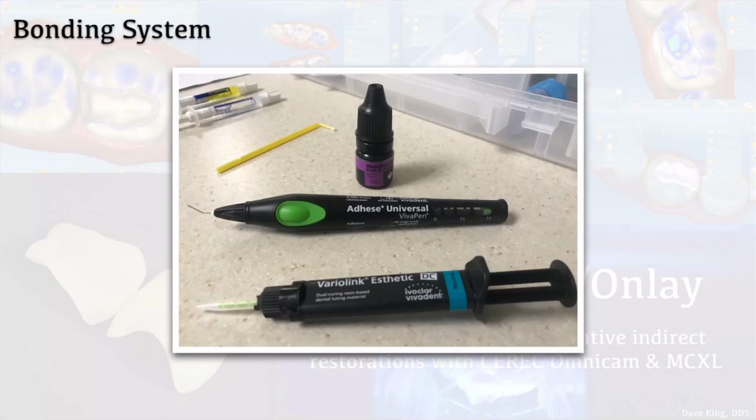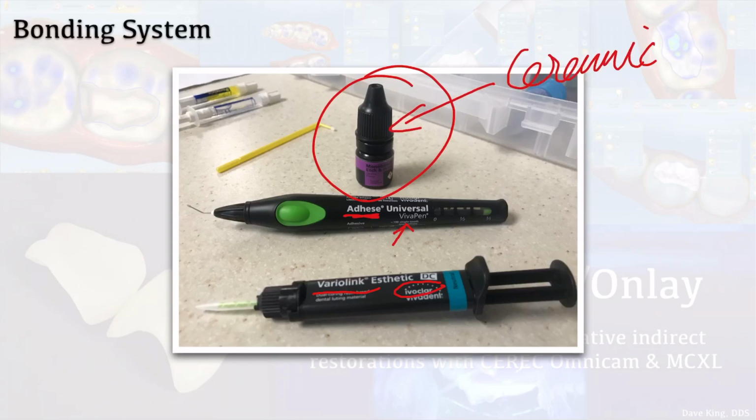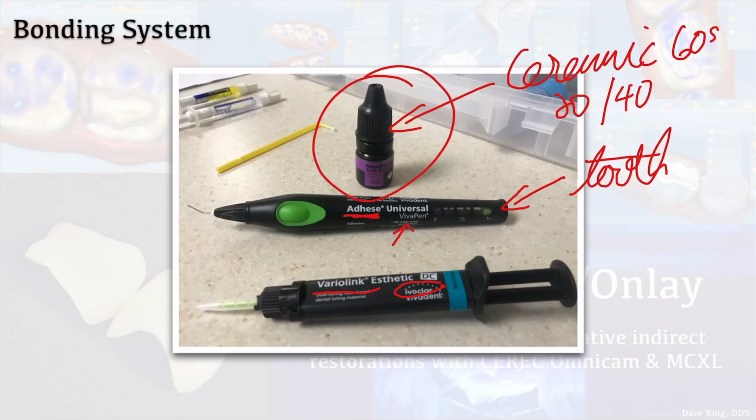This is what I use. Monobond Etch and Prime, which is an Ivoclar product, the Adhese Universal in the Viva pen, which is also an Ivoclar product, and Variolink Esthetic, which is also obviously an Ivoclar product. I really like how these materials work together. It's a very simple bonding protocol. This is for the restoration, for the ceramic, and of course this is for the tooth. This takes 60 seconds. It's a 20-second scrub and a 40-second leave it alone. This is a 20-second scrub, an air dry and a light. And then you apply the cement, and we're going to go through that.